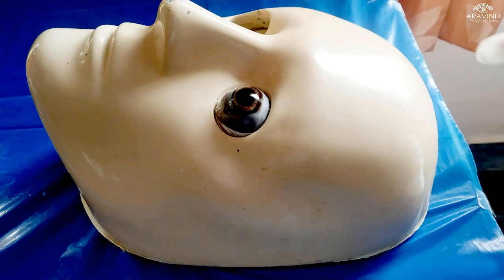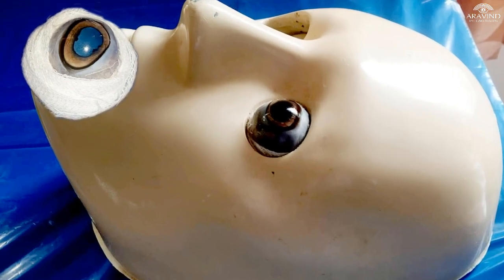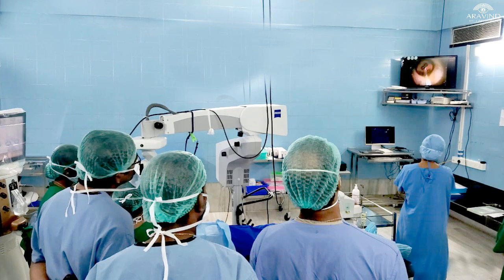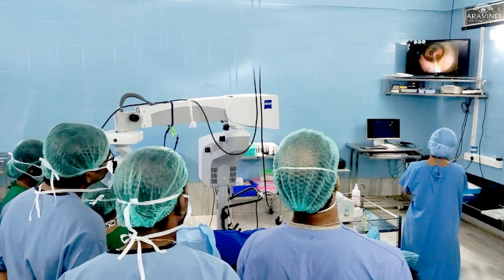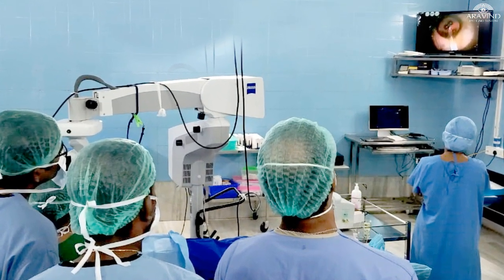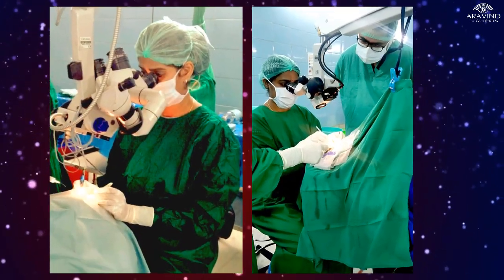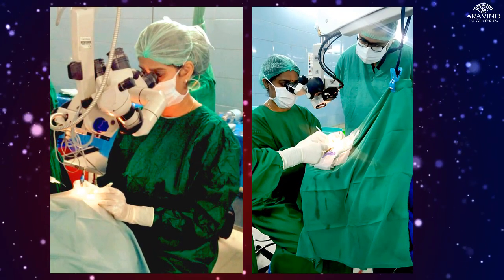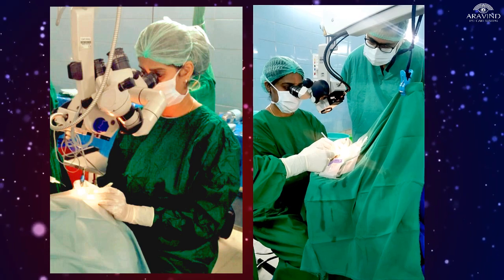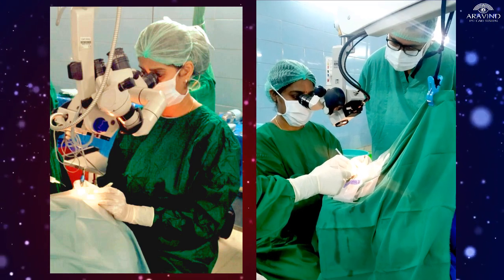virtual simulators and animal eyes have been described as training models. This helps residents overcome their initial fear of operating on patients and provides opportunities to address issues such as handling the microscope, depth perception, and understanding the FACO emulsification machines.